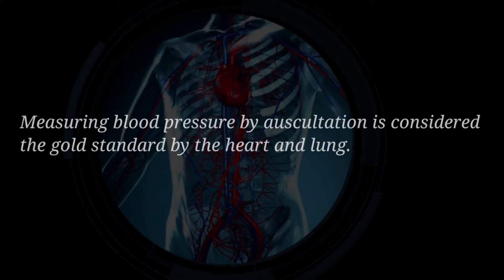Measuring blood pressure by auscultation is considered as the gold standard by the heart and lung.